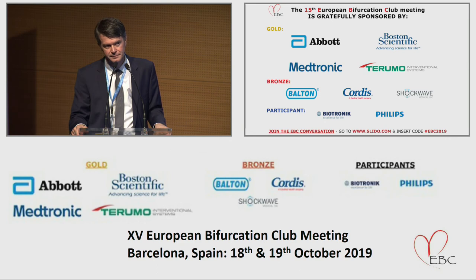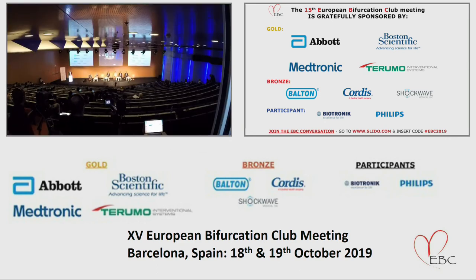Yeah, thank you very much. I think there is data on devices like this. One is published by Bruno Scheller, and there are also other devices. We have used some of them in Spain. My personal experience is that you need to have the right balloon, the right length, and this can be tricky. In theory, this is a good strategy, but I don't see a problem using any scoring balloon and then using your drug-eluting balloon.